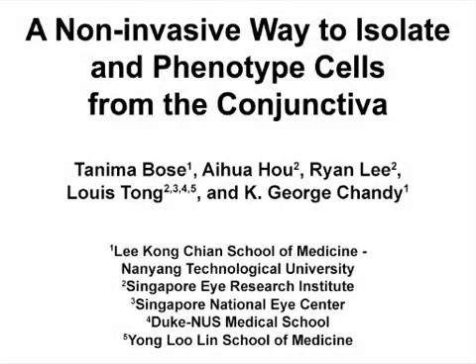The overall goal of this impression cytology technique is to derive enough cells to immunologically phenotype the cells involved in ocular surface disease. This method can help answer questions in the field of ocular surface, such as which immune cells are important for ocular surface inflammation. The main advantages of this technique are that it is relatively non-invasive and simple to perform in the clinic and the lab.